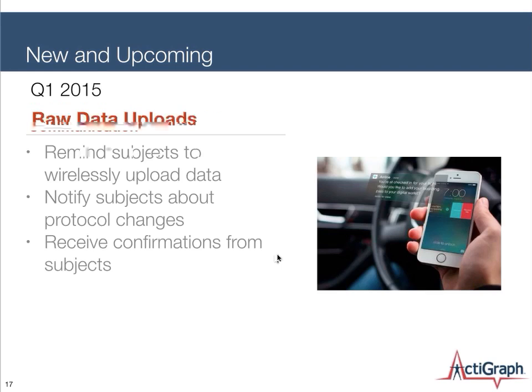Raw data uploads is high on our priority list, and so today you do have to have the device in hand to get the raw data. Coming in Q1, that data will automatically be uploaded to the study admin system, and as you can imagine, there are some logistical challenges with that data because of the magnitude and size of it, and so we're working through some techniques to solve that problem in low bandwidth sites. And so that data will then be available, and as I've mentioned here in this bullet, exportable to a number of formats, and SPSS being one of those.